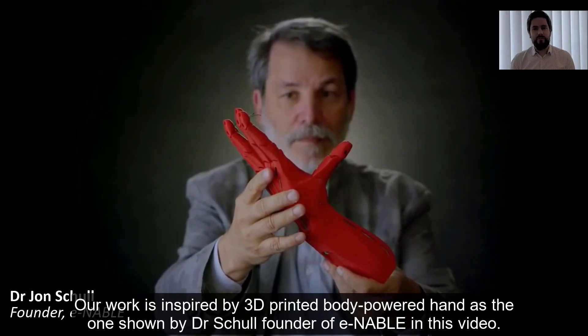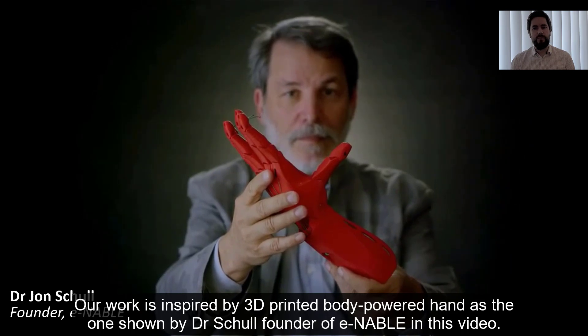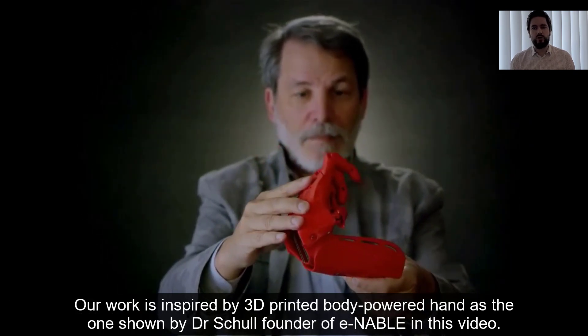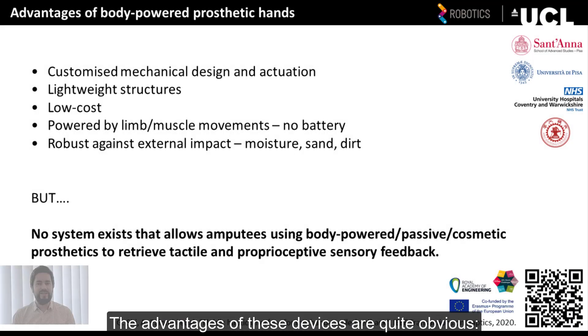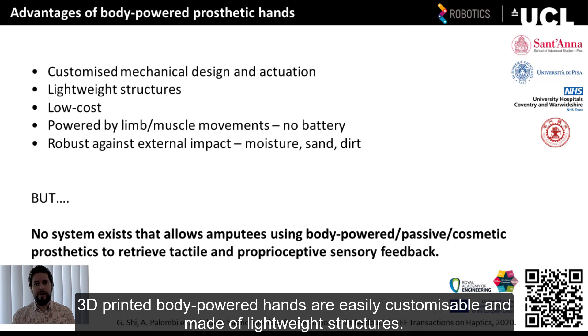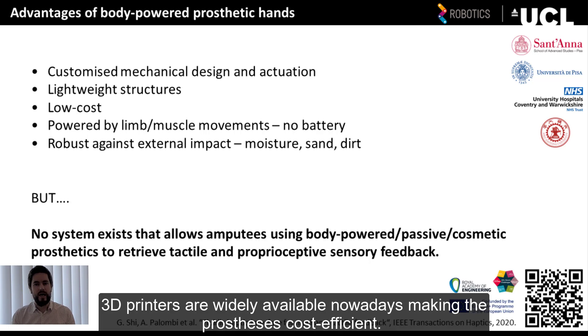Our work has been inspired by 3D-printed, body-powered hands as the one shown by Dr. Jon Schull, founder of e-NABLE in this video. The advantages of these devices are quite obvious. 3D-printed, body-powered hands are easily customizable and made of lightweight structures. 3D printers are widely available nowadays, making the prosthesis cost-effective.